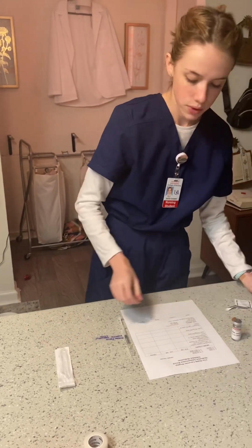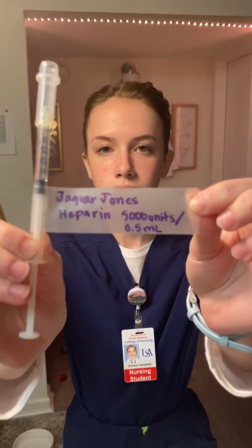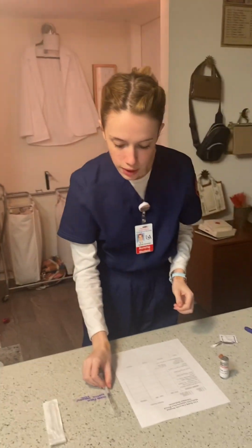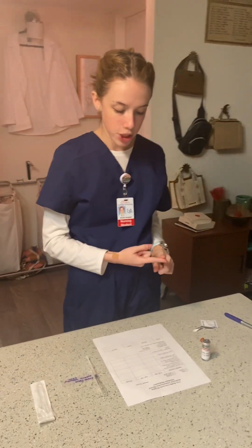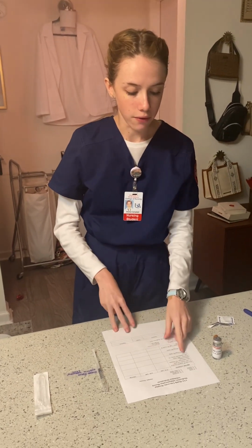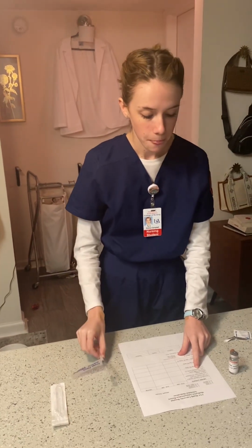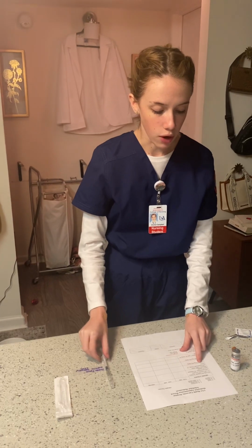I'll finish with that, and I'm going to go ahead and show this label to the camera. Now that I have verified the right patient, the right medication, the right dose, I'm going to verify the right route, which is subcutaneous, and that's why we've got our TB syringe with our TB needle right here. The right time is every 12 hours, and it has been 12 hours.